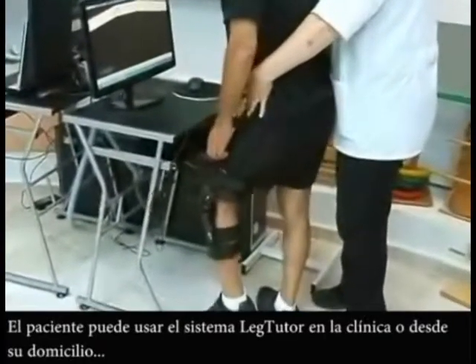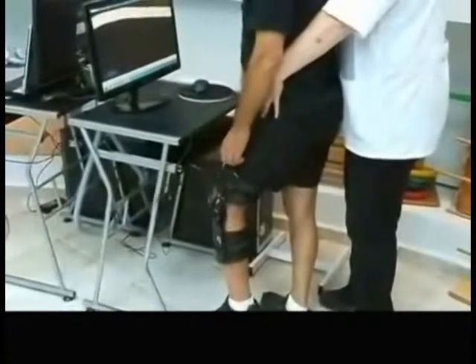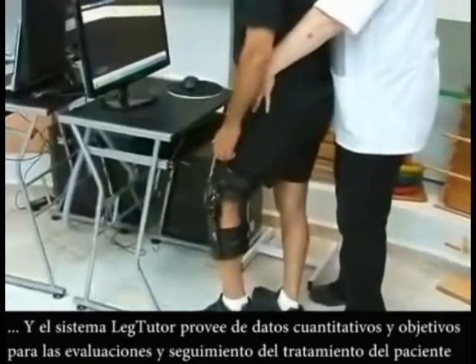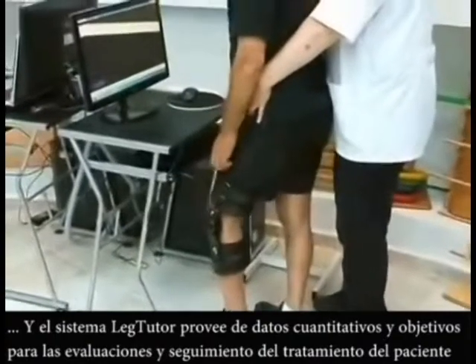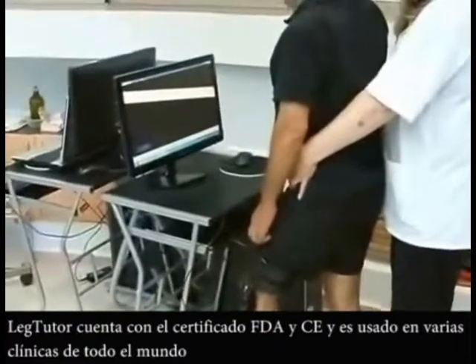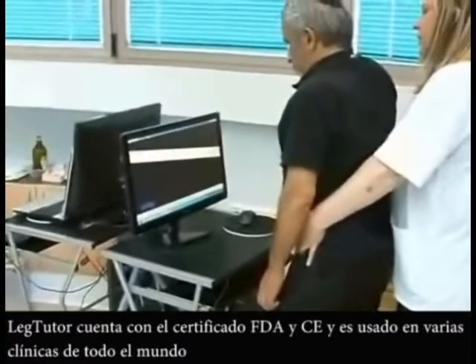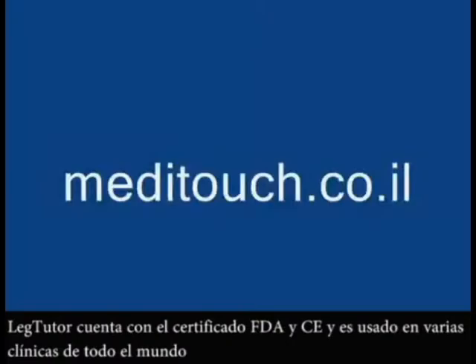The patient can use the Leg Tutor in the clinic and the home care environment. The Leg Tutor system provides objective and quantitative evaluations on the patient's treatment progress. The Leg Tutor has full FDA and CE registration and is used in many clinics worldwide.